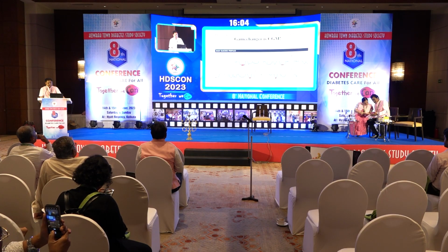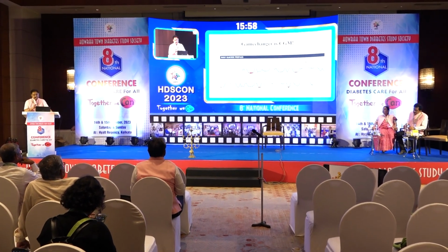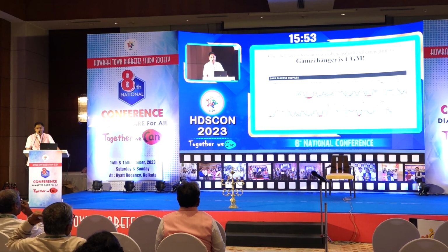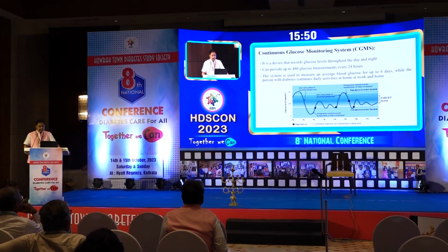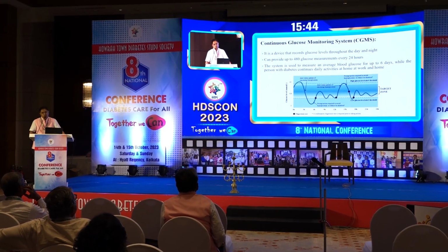So ambulatory glucose profile is nothing but a summary of the continuous glucose profile over a period of time, like the 14 days, as madam said. Coming to this is the daily glucose profile, that when the patients actually do these measurements, they take the daily glucose of this interstitial glucose, and you can see the difference in the different days, starting from Tuesday to Sunday, the glycemic excursion, different parts of the time of the day that varies even in the single patient. So this continuous glucose monitoring system gives the records of the glucose throughout the day and night.